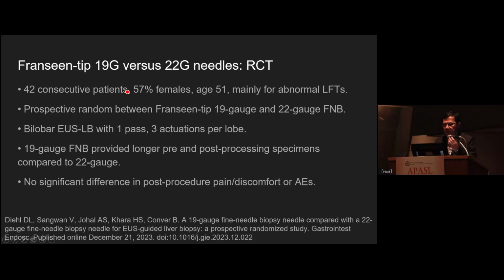And when we look at this randomized controlled trial, just published in 2023, they compared only FNB needles, Franseen tip, but with different needle diameters, 19 versus 22 gauge.